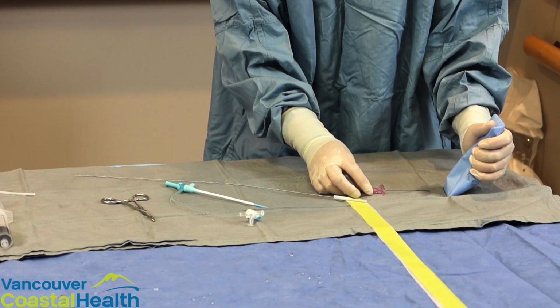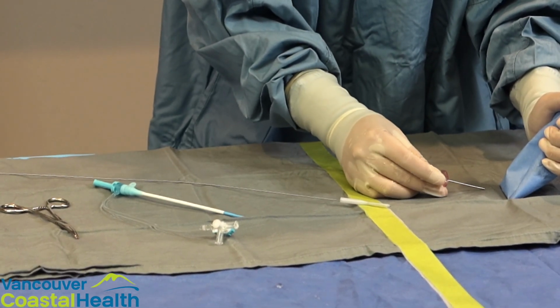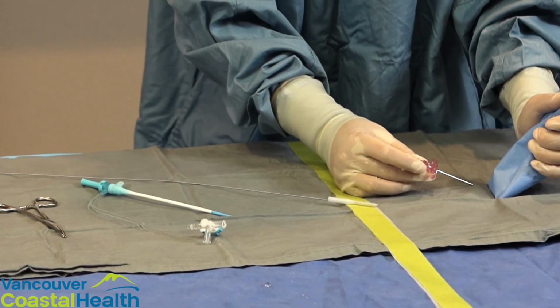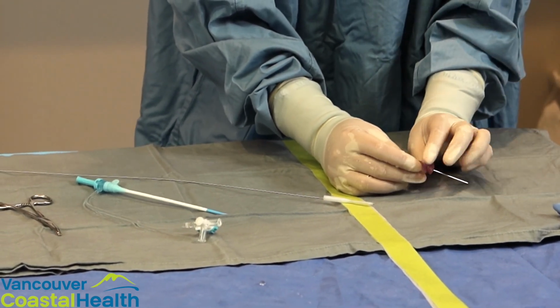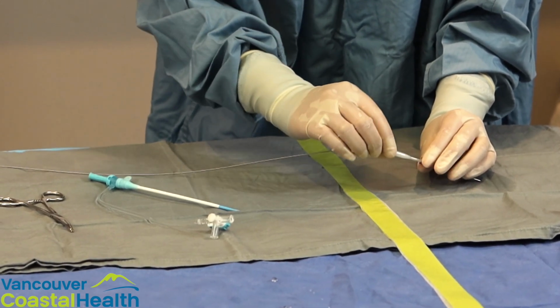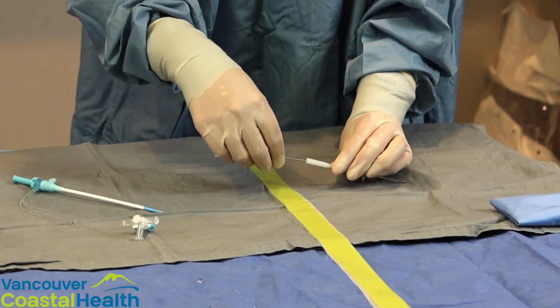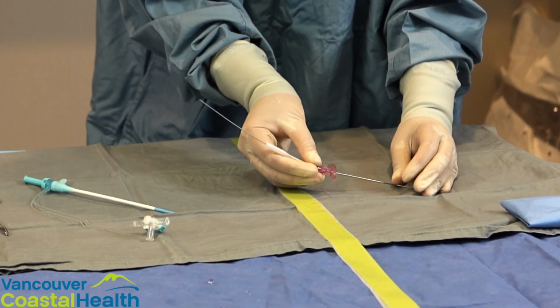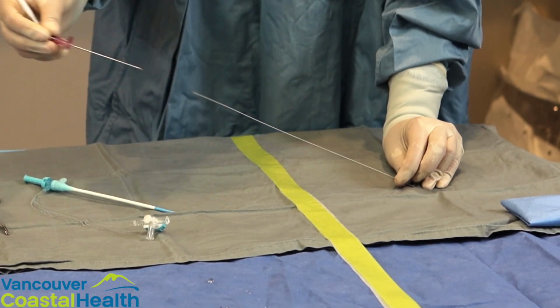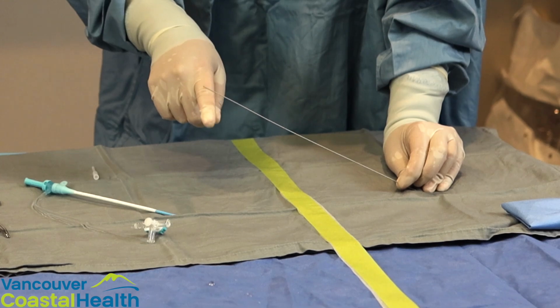So they're ultrasounding. Once they find the vessel, they'll puncture in with their access needle. And at this point, if they see some blood coming back and they see that they're in the target vessel, they'll lay the ultrasound aside and put in the wire. The wire will be used to maintain the place inside the blood vessel, and then at this point, the needle can come out. We can see that the wire is maintaining our place.